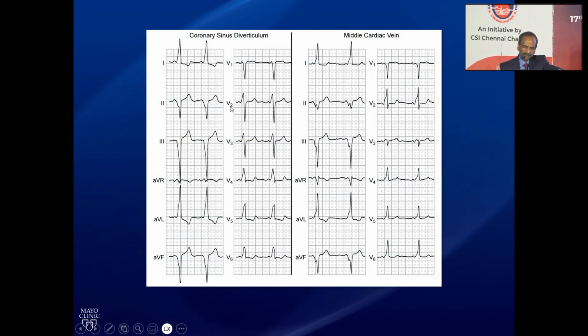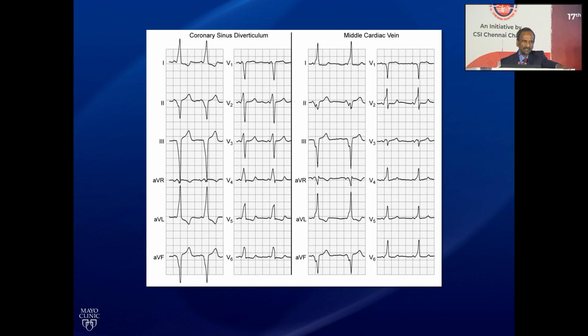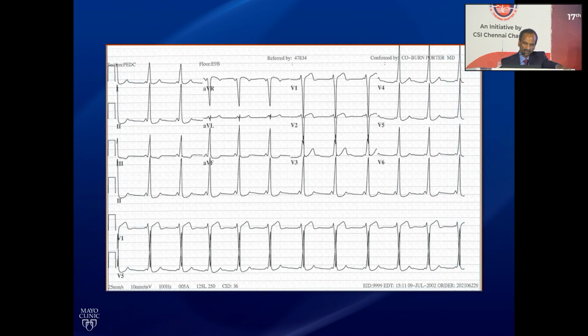So 2 areas. So this is one that you should get your mind used to. Look at lead 2, completely negative. So completely negative, you're thinking this is epicardial connection. Epicardial can happen in multiple sites, but it's usually a left lateral epicardial, posterolateral epicardial, posterior or posterolateral, and you'll ablate in middle vein or in a posterior lateral vein to be successful in that case. I'll talk a little bit about that case.